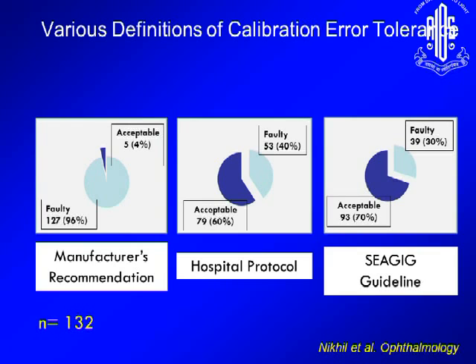So based on our own information, now we calibrate almost every 4 months, and what we also recommend is that first thing in the morning when you come, just slide the knob back to 0 and see whether your tip moves back. And then just move it forward. If it moves forward, you at least know that it's accurate at 0 millimeters. And that's something all of us need to keep in mind.